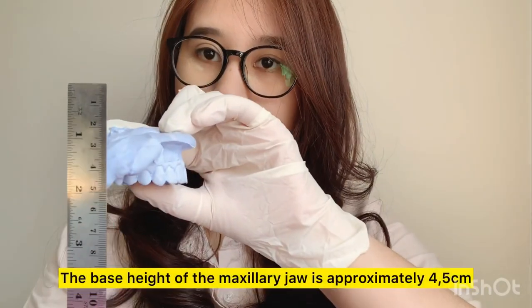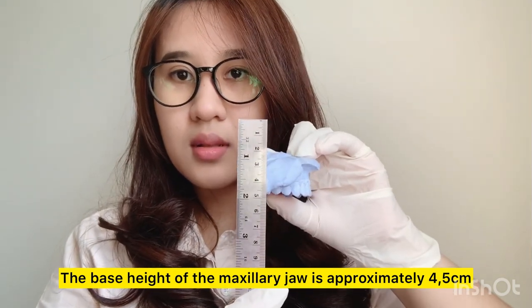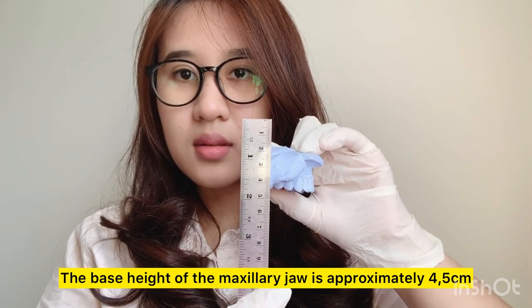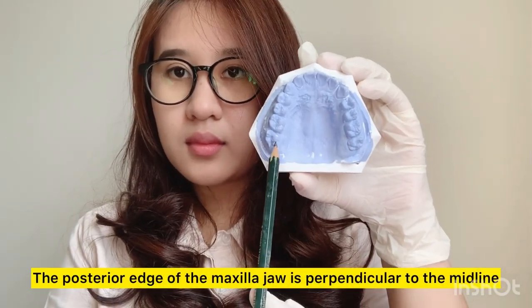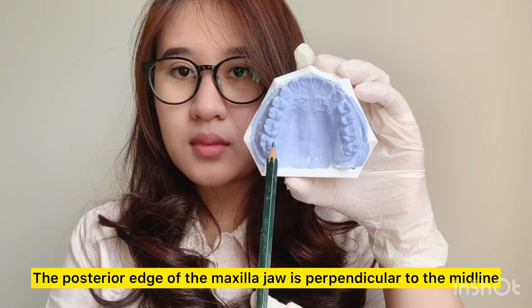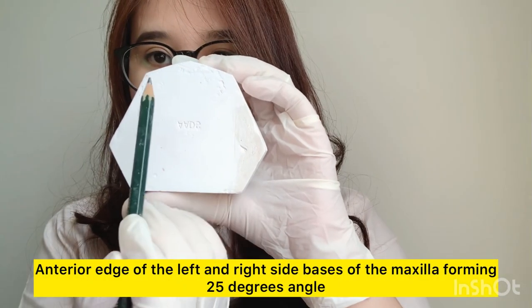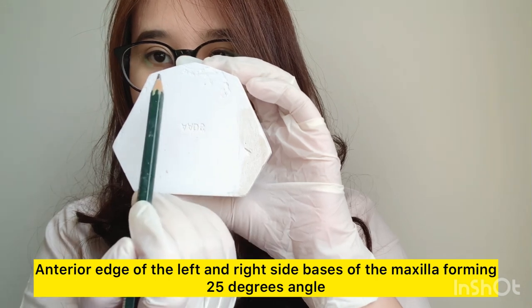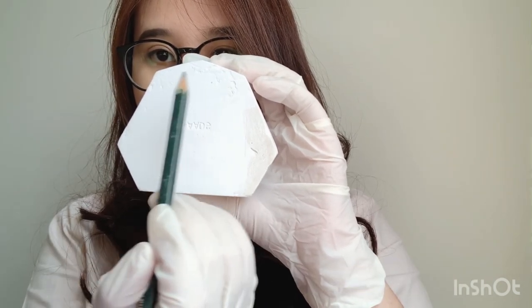And we can continue to measure the base height of the maxillary teeth. It is approximately 4.5 cm. The posterior edge of the maxillary jaw should be perpendicular to the midline. The anterior edges of the left and right bases of the maxilla form an angle of 25 degrees.